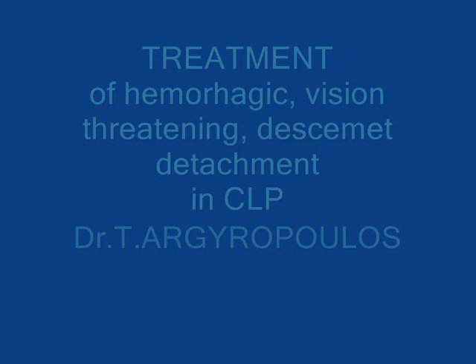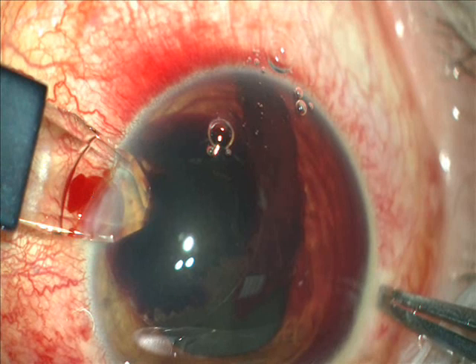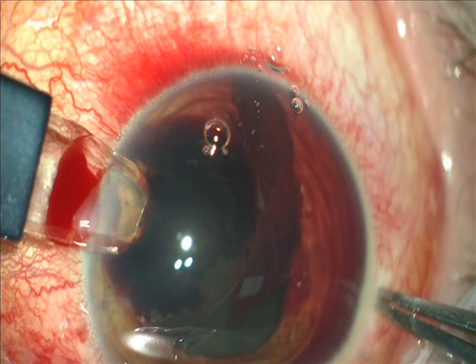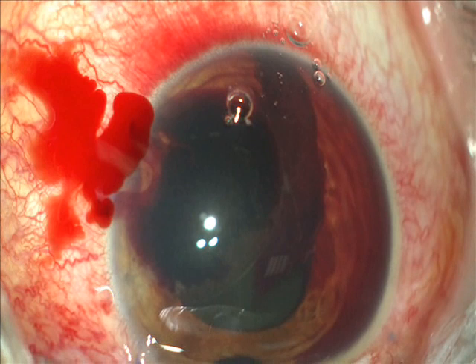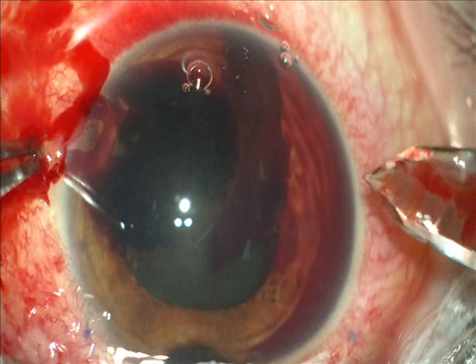This video shows the treatment of a hemorrhagic, vision-threatening Descemet's detachment during canaloplasty. This is a vision-threatening complication. Here you can see the hemorrhagic Descemet's detachment. The context there is Healon and blood, and you see also blood and clot in the anterior chamber.